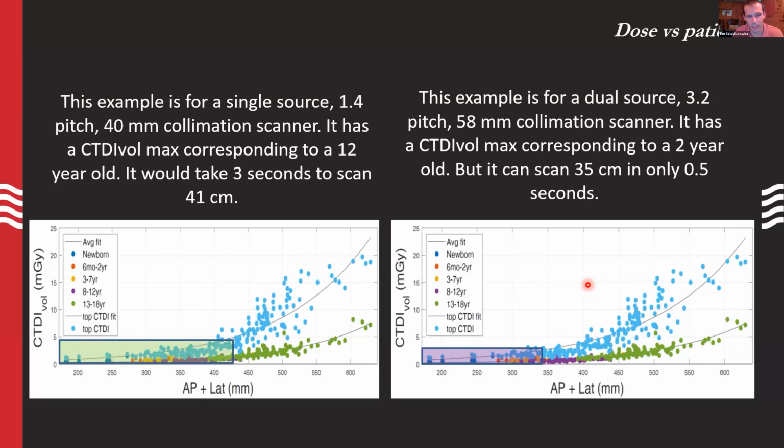And one of the benefits of CT is that it's fast and you can avoid sedation, right? But if your scan's taking a really long time and the kid's moving, we still might have peds sedation. I mean, that's common, right? Still in the CT setting. But if you take advantage of really fast scan modes, you actually can mitigate a lot of the need for that. We did that when we got our first wide axial scanner at my institution, where we could scan basically multiple times faster than any other scanner in our fleet before that. And we started rolling out these sedation-free peds protocols. But anyway, back to this slide.